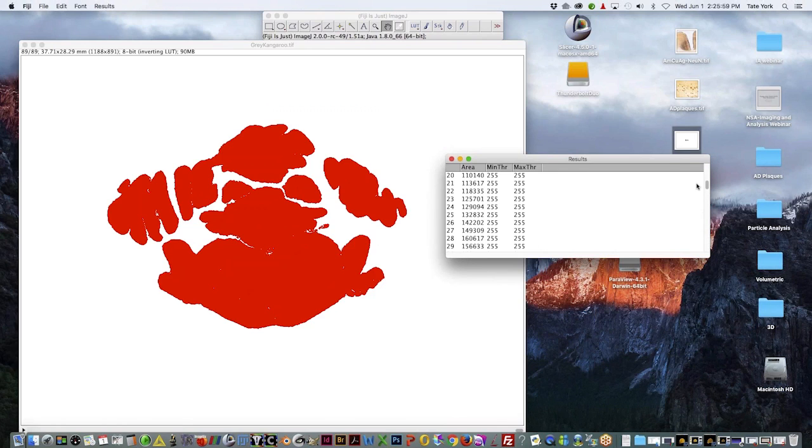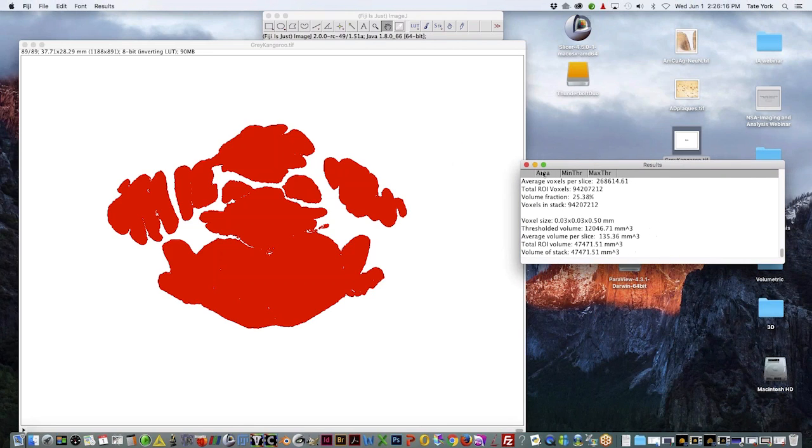So this is the image I mentioned earlier that shows the ellipsoid method, kind of a breakdown of what's being measured to give you your volume approximation. So this is just a general ellipsoid shape, a region of interest. And so you're taking measurements A, B, and C and putting those into a formula, and it's going to give you your volume.